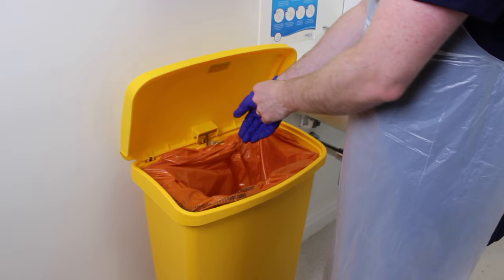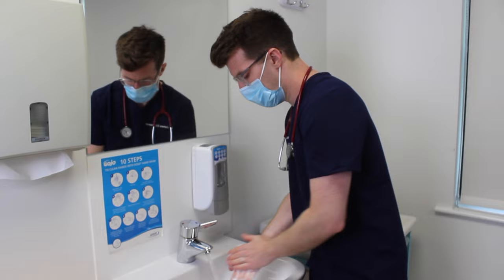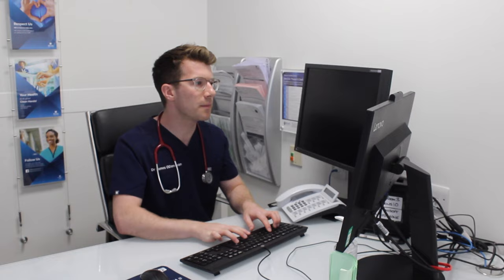Wash your hands and finish off by documenting your findings.